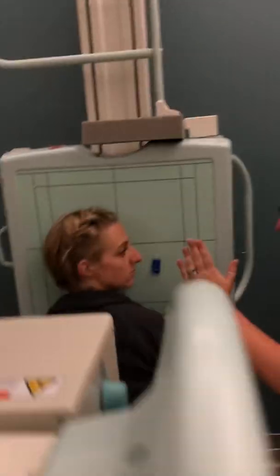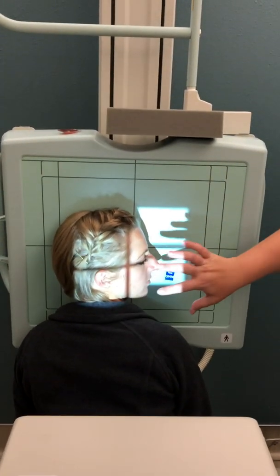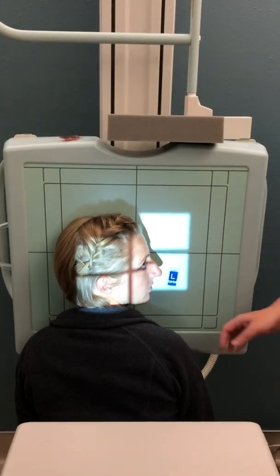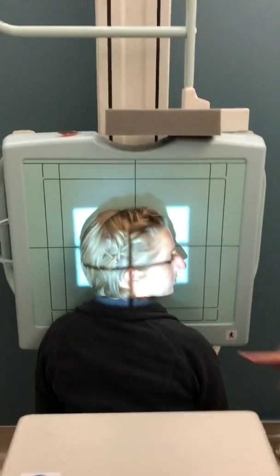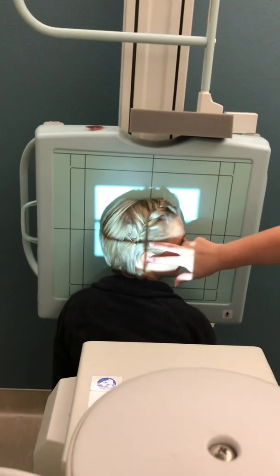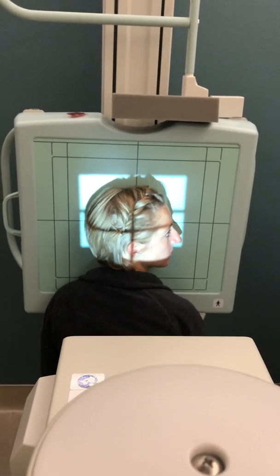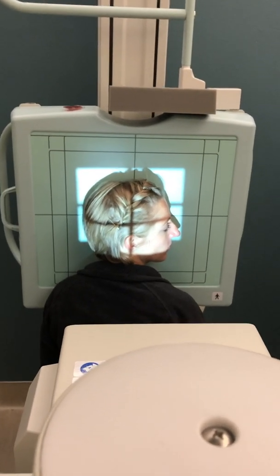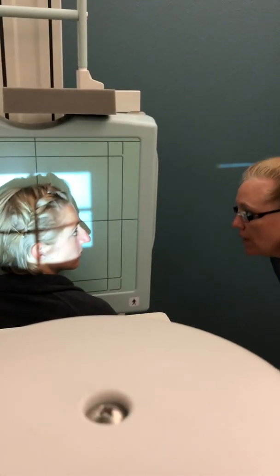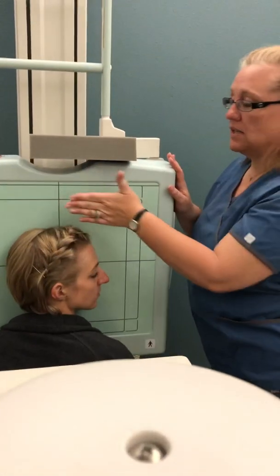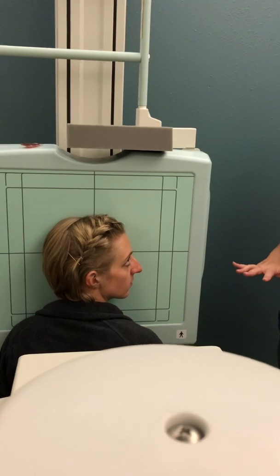Bring your chin and nose over — very good, just like that. This would be perfect if I was doing facial bones, but since I'm doing skull, I'm going to bring you gently towards me. The central ray has to be two inches above the EAM, so I'd have to adjust my bucky up. You have to get down on the level of your patient to really, truly evaluate. That's why it's important that they be either seated or laying down.